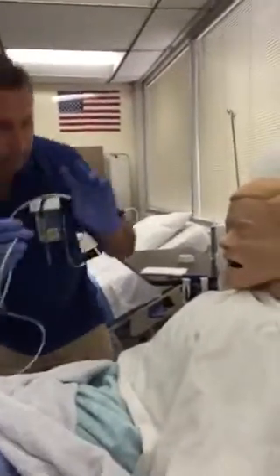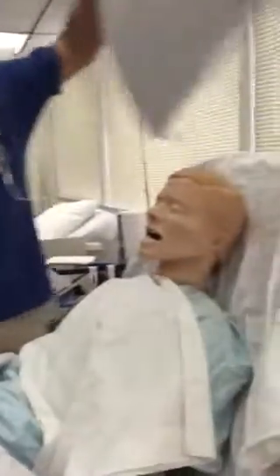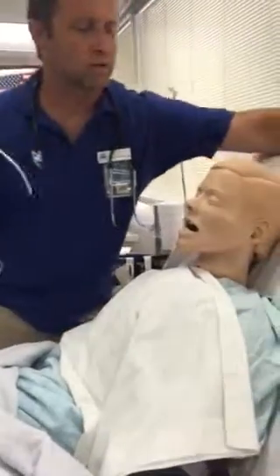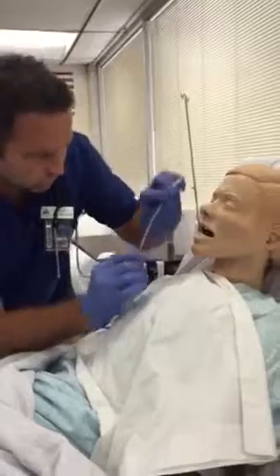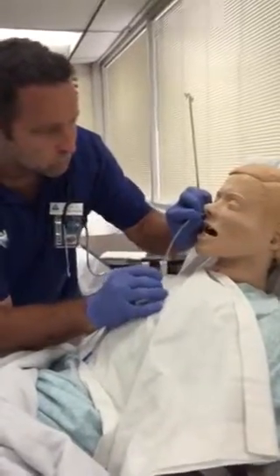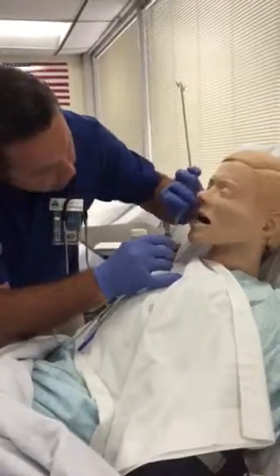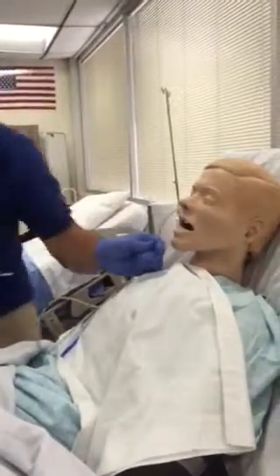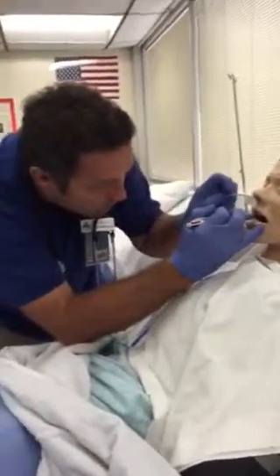Okay, here we go. And I'm going to go through the right nare. We're going to ask him to keep the cup handy, we need it back in a minute. I'm going to need to ask you to tilt your head back a little bit and try to relax for me if you can. All right, here we're going to begin. Insert, insert, insert. Now, toward the rear pharynx, with my pen light, I inspect, just to make sure the tube is not coiling up in his throat, and we're not, we passed.